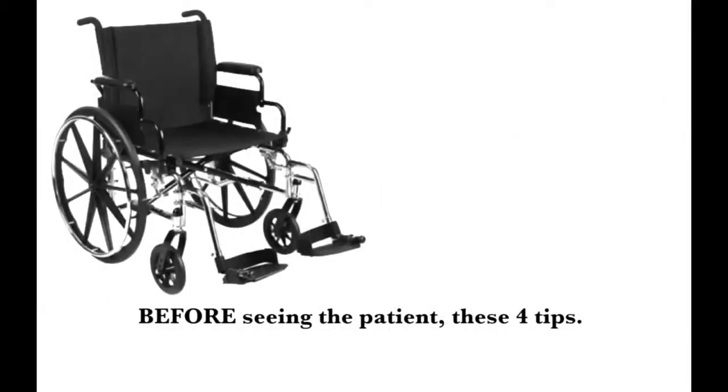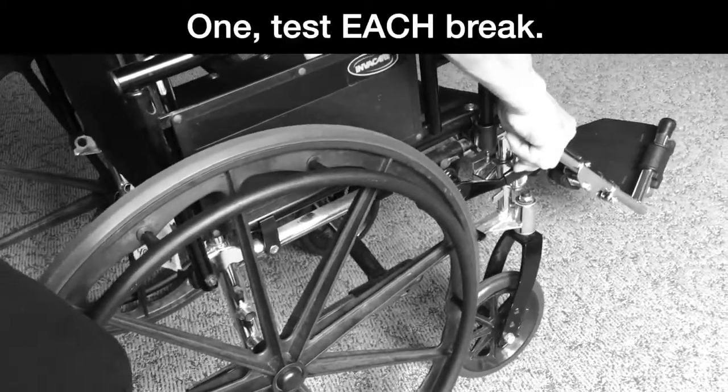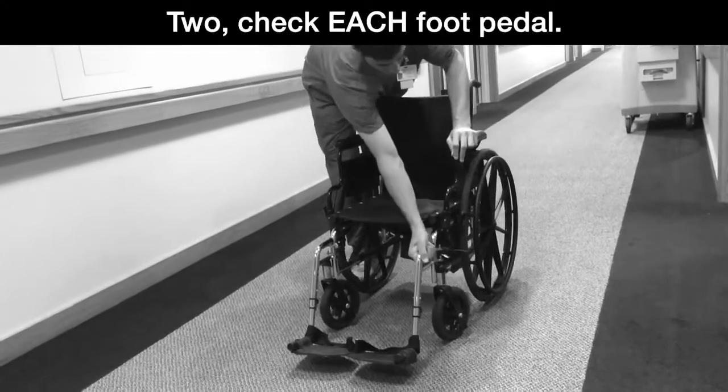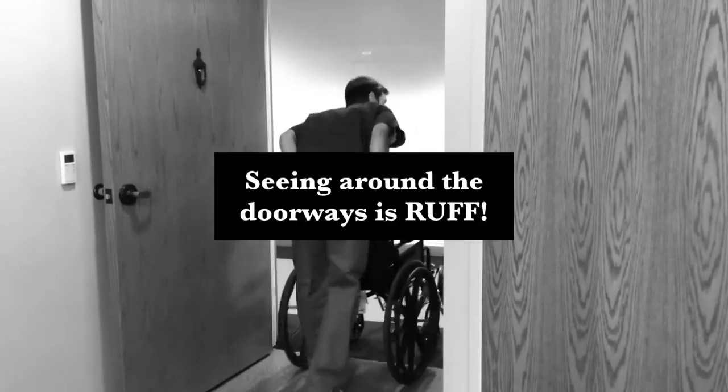Before seeing the patient, these four tips. One: test each brake. Two: check each foot pedal. Seeing around the doorways is rough!